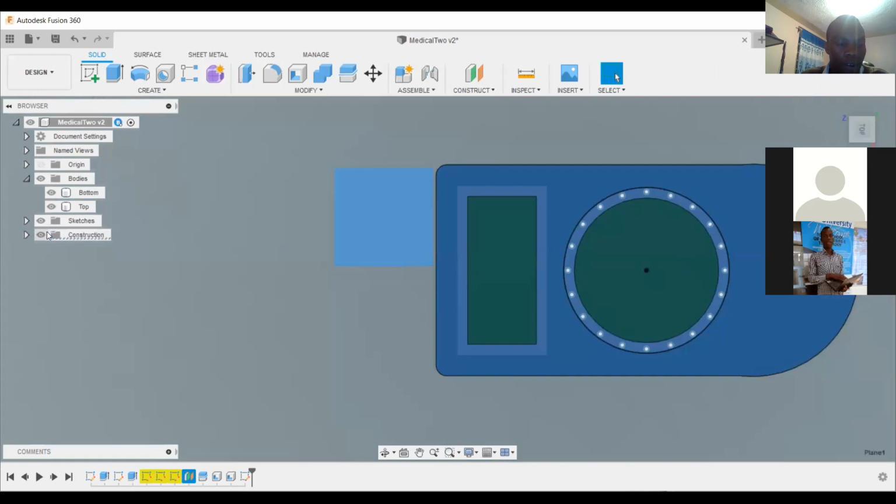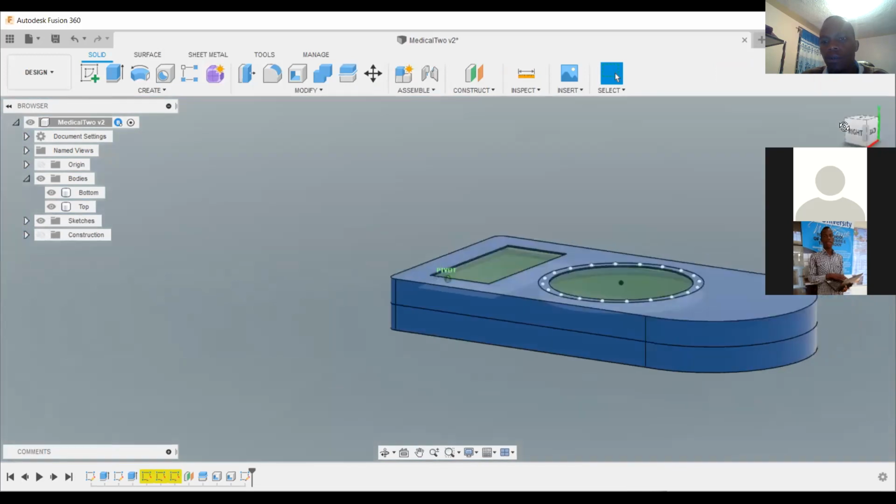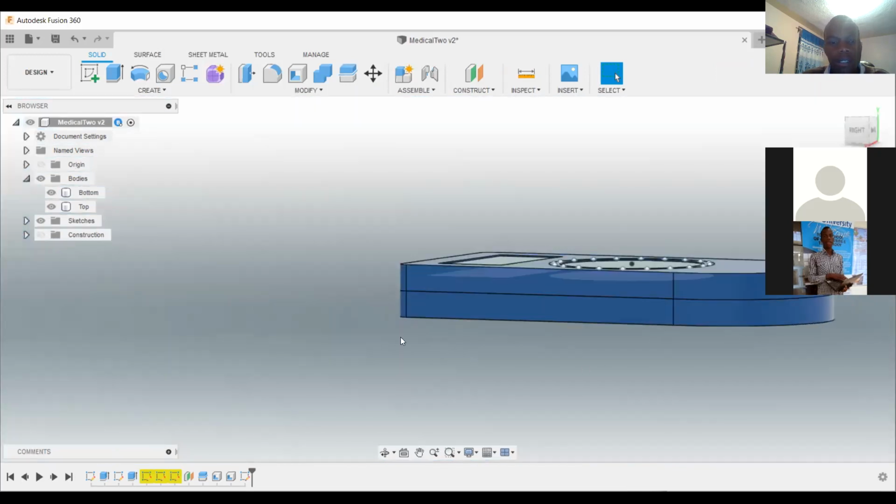There was this plane. I told you last time, you come to your left-hand side, then there is construction, you can hide it. You come here, you hide the plane so that you don't have any problem. So we are having 2 parts, the bottom and the top.